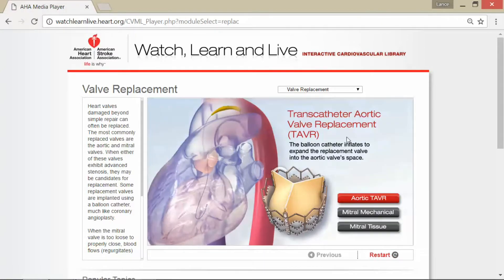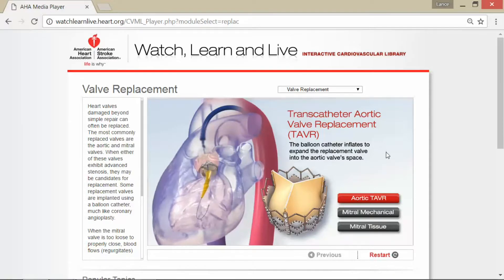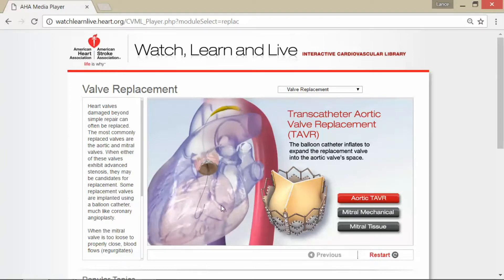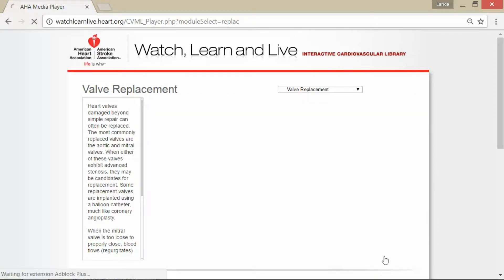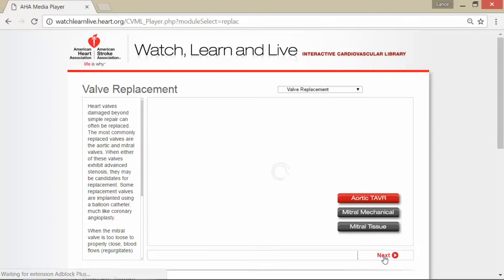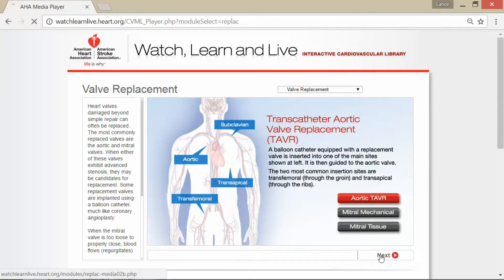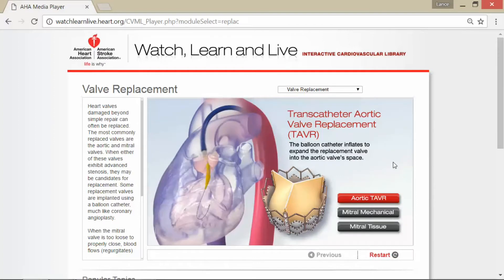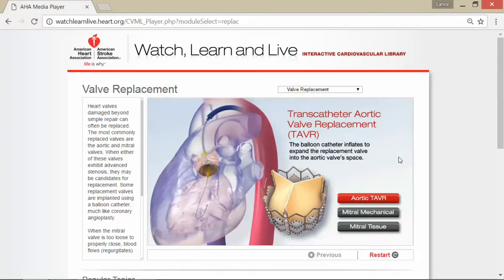You can see how the transcatheter aortic valve replacement works in the animation. The balloon catheter inflates to expand the replacement valve into the aortic valve space. The catheter places the valve, which then begins to open and close as the heart pumps blood. Hitting reset shows the process again — the catheter re-enters the heart and the valve opens and implants.